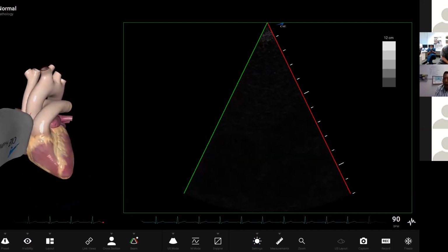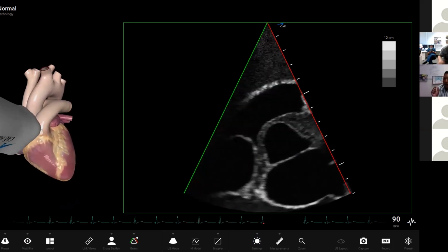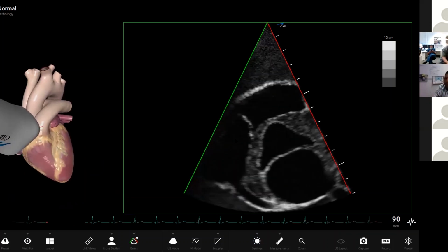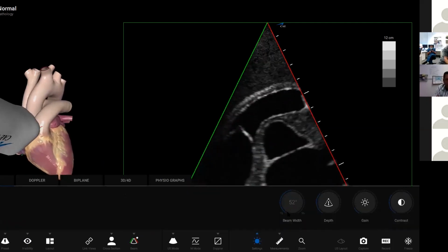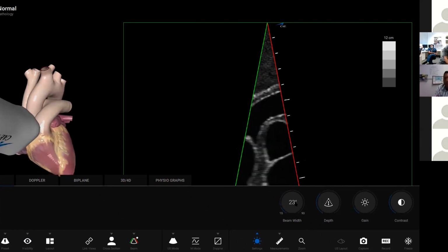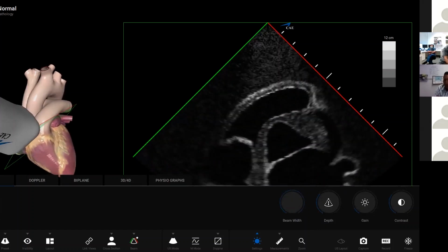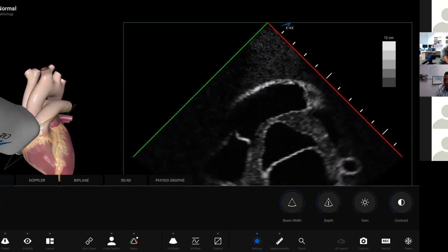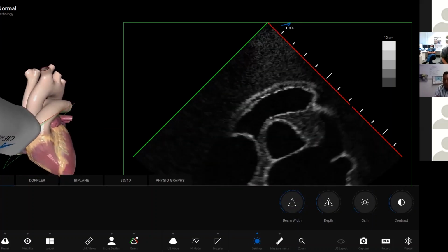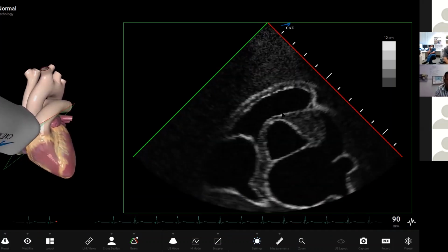Okay. And the angle, is it? The angle you can change it whatever you want, but depending on the sector width, you can angle it more. The smaller the beam width, the more you're going to be able to angle it. Because the echo can take up to maybe an image like 90 degrees, and if you were to section it down, you could just look at that, and that's the bit that you'd be moving over one way or another. So it's all just changing the phase of the array. Okay, thanks.